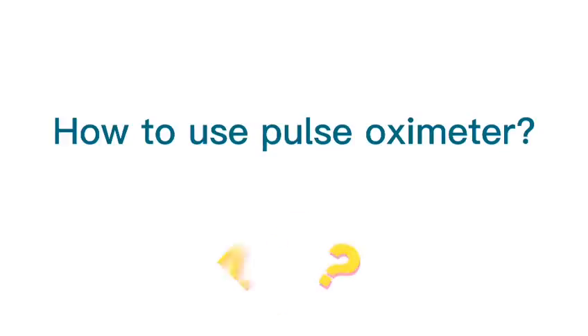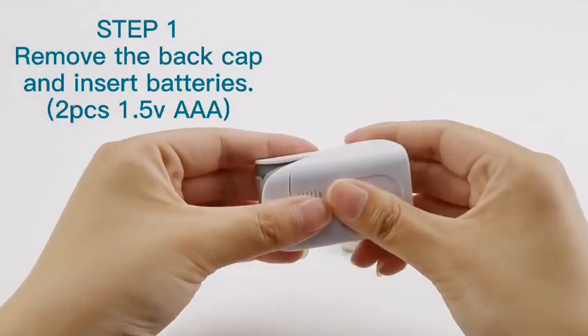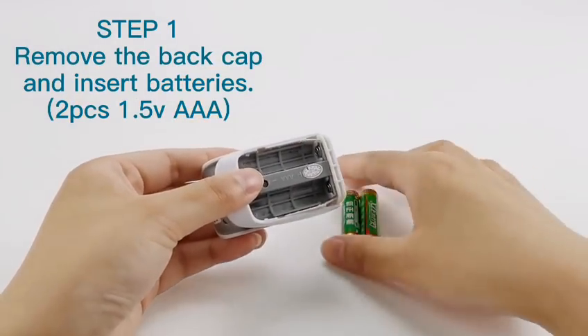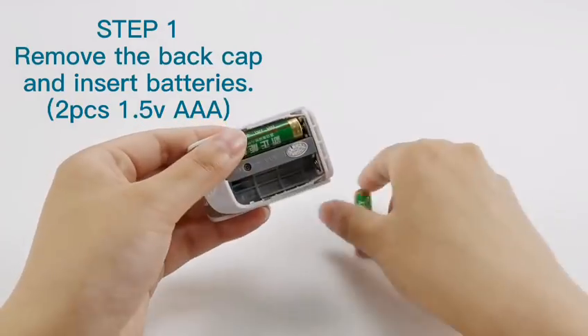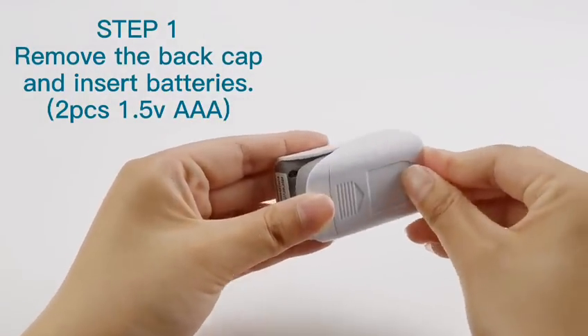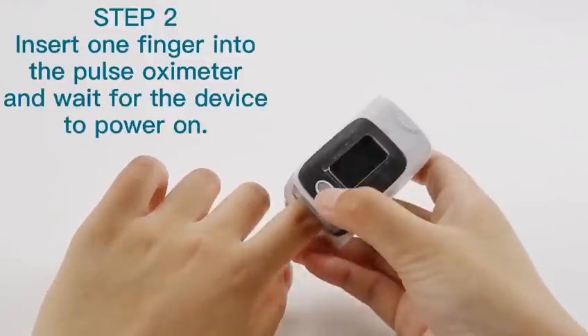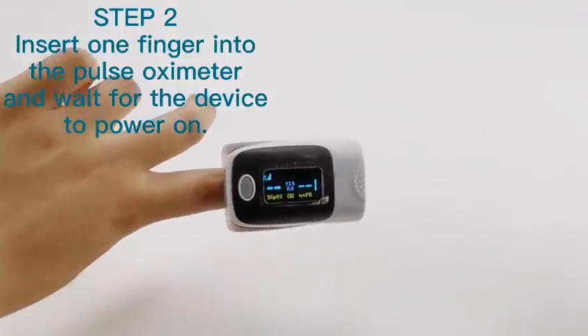Many people wonder how to use the Pulse Oximeter. To begin, remove the back cap and insert the batteries as shown here. Once ready, insert your finger into the Pulse Oximeter and wait for the device to power on.